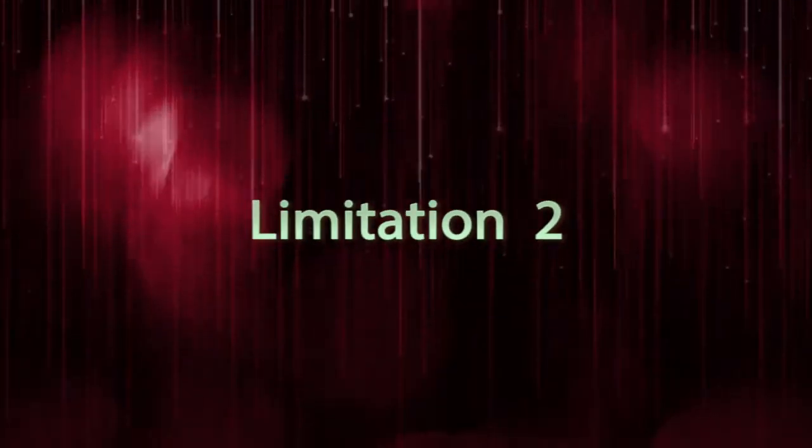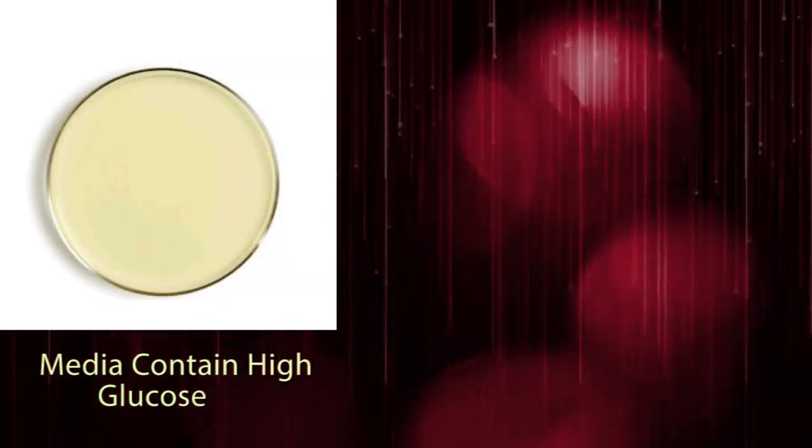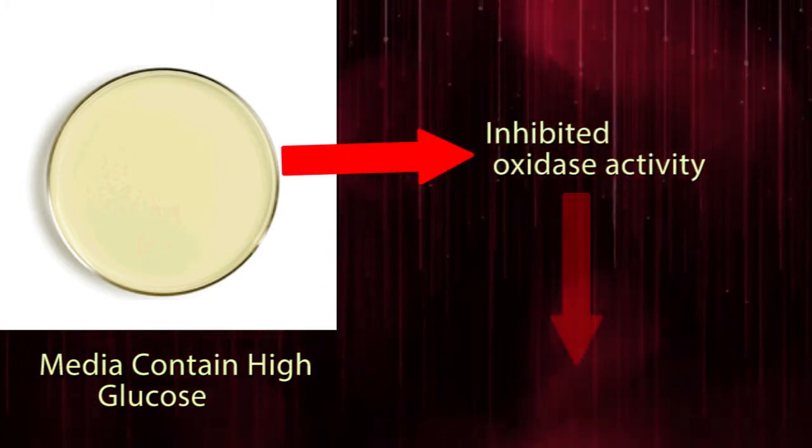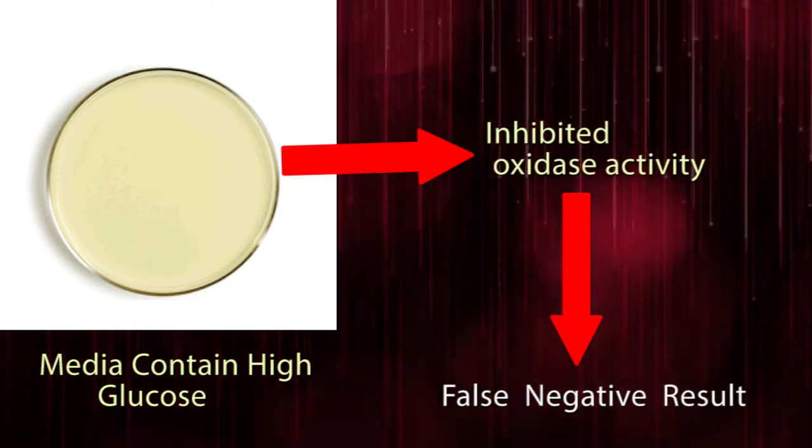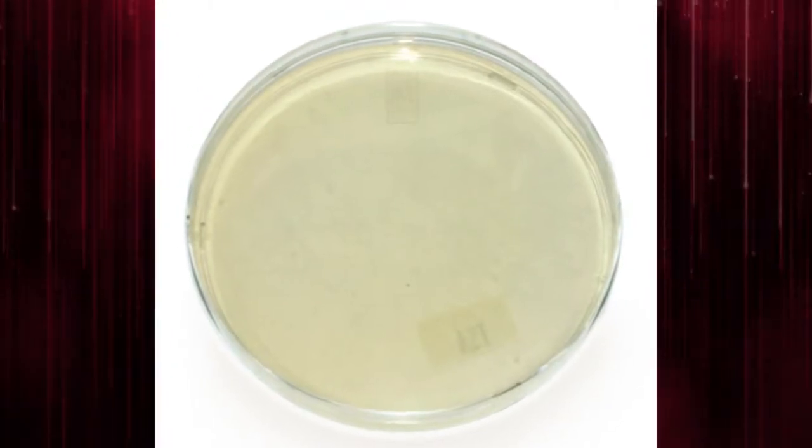Limitation Number 2: Both bacteria and yeast grown on media containing high concentrations of glucose show inhibited oxidase activity. So results can be false negative. It is recommended to test colonies grown on media without excess sugar. Tryptic soy agar is also an excellent media.